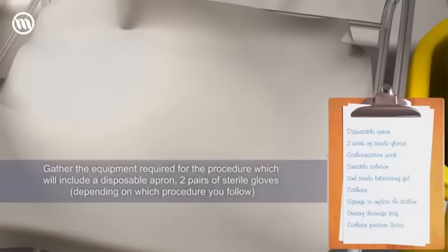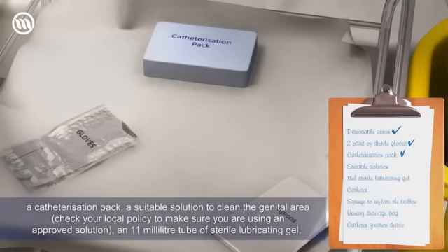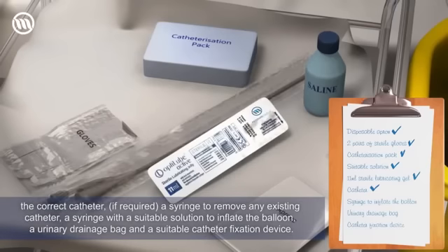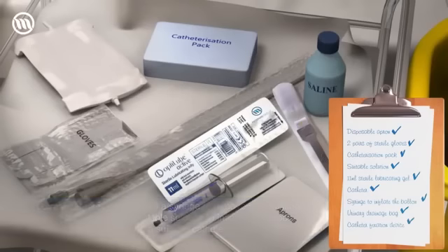Gather the equipment required for the procedure, which will include a disposable apron, 2 pairs of sterile gloves, depending on which procedure you follow, a catheterization pack, a suitable solution to clean the genital area. Check your local policy to make sure you are using an approved solution, an 11 mL tube of sterile lubricating gel, the correct catheter, if required, a syringe to remove any existing catheter, a syringe with a suitable solution to inflate the balloon, a urinary drainage bag, and a suitable catheter fixation device.